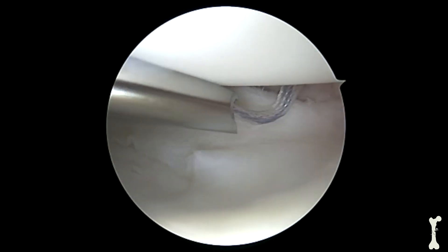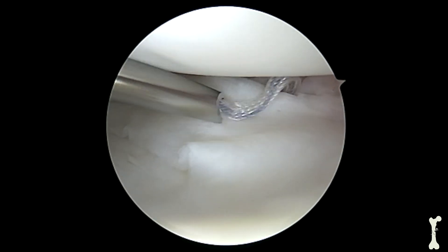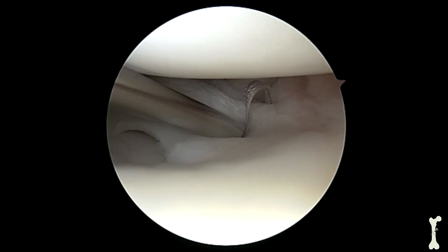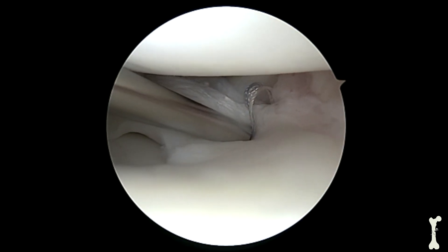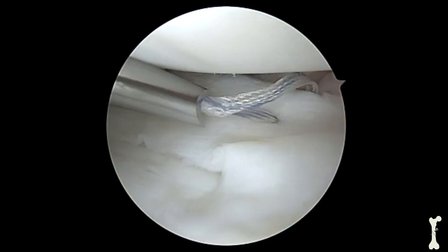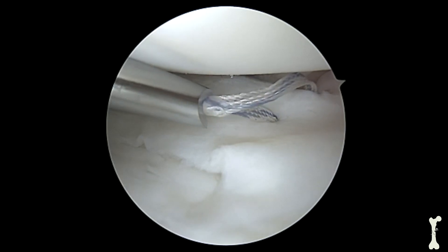After the first stitch is in place, we'll place our second needle which will pass the remaining limb of this suture. We find the right spot on the meniscus and then we pass the needle through the meniscus tissue and out through the knee through, in this particular case, an accessory incision to protect the neurovascular structures. The suture is then shuttled through the meniscus tissue and tightened, which secures the repair.